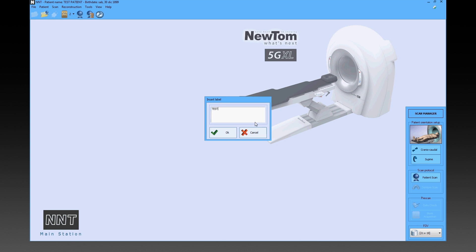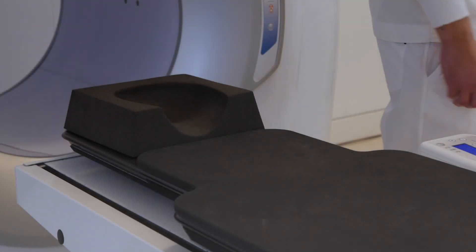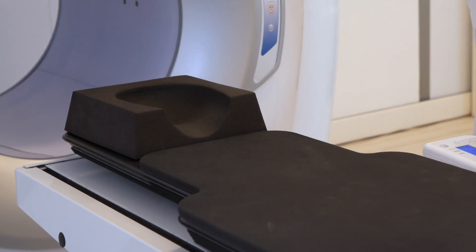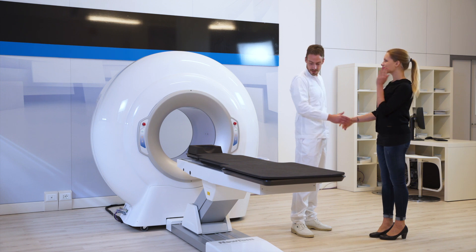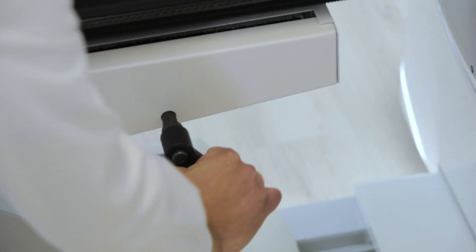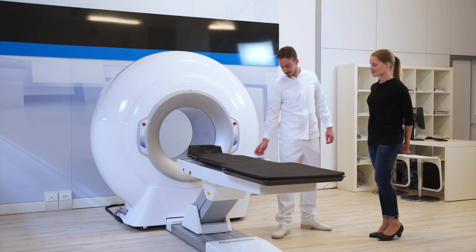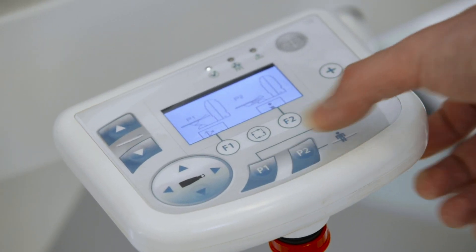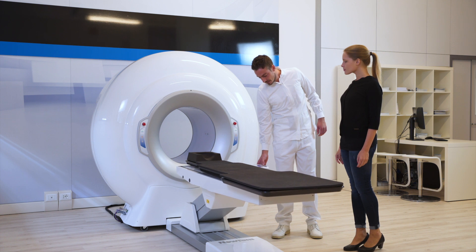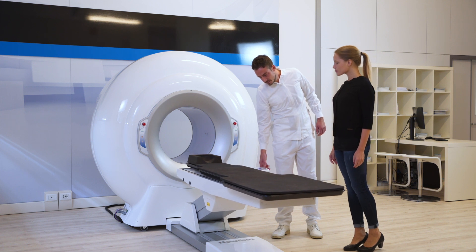We are ready to place the patient on the table. The gurney must be fully removed from the gantry and locked by the handle located next to the keypad. Then press the P2 button on the table control pad to bring the table to the default position.